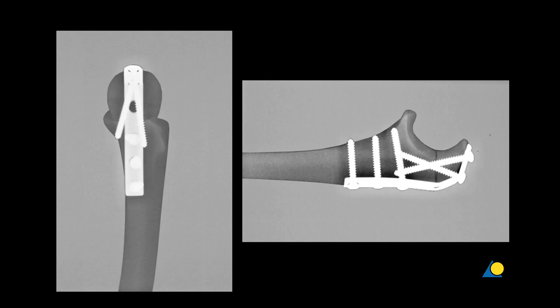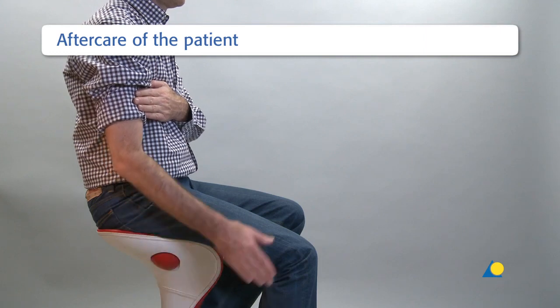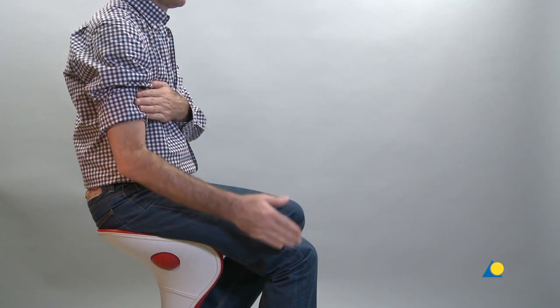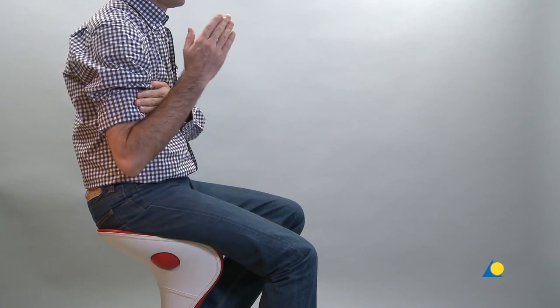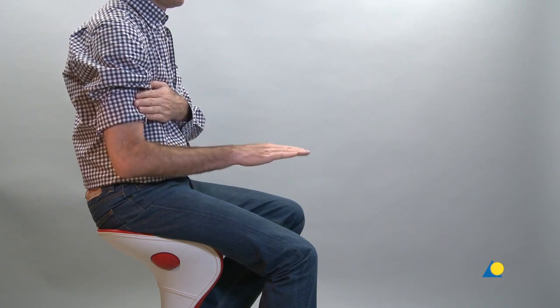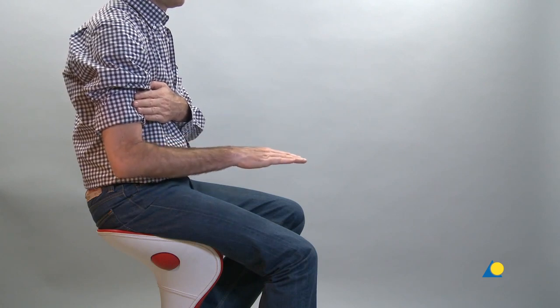These are the X-rays of the plastic model. Note that if the fracture line is more distal, longer screws should be used. Active assisted motion is encouraged within the first few days, including gravity-assisted elbow flexion and extension. The patient should be encouraged to move the elbow actively in flexion and passively in extension, pronation, and supination as soon as possible. Any loading of the elbow over 3 kilograms should be avoided for 6 weeks.